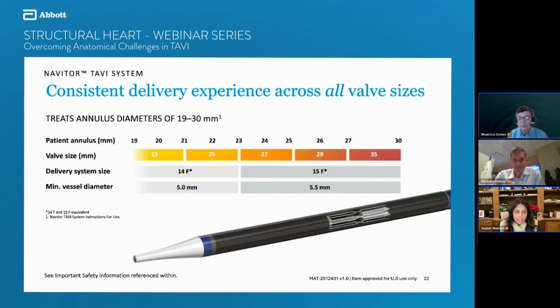I do, yeah. I think you make an excellent point. If you have somebody who's at least manning the wire, I do think there is the capacity to do this as a single operator. And you have really intricate control over the precision of the placement.